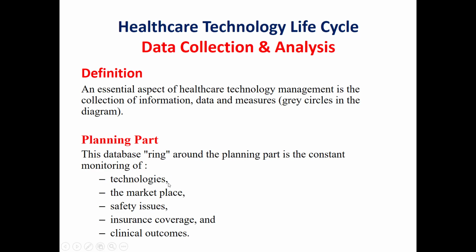Technologies, for example, sometimes, as we said, we have new emerging technologies or trends, new medical equipment trends. It is important to gather information about them in case we need to make a decision for the procurement of a new device or the replacement of our old technology.